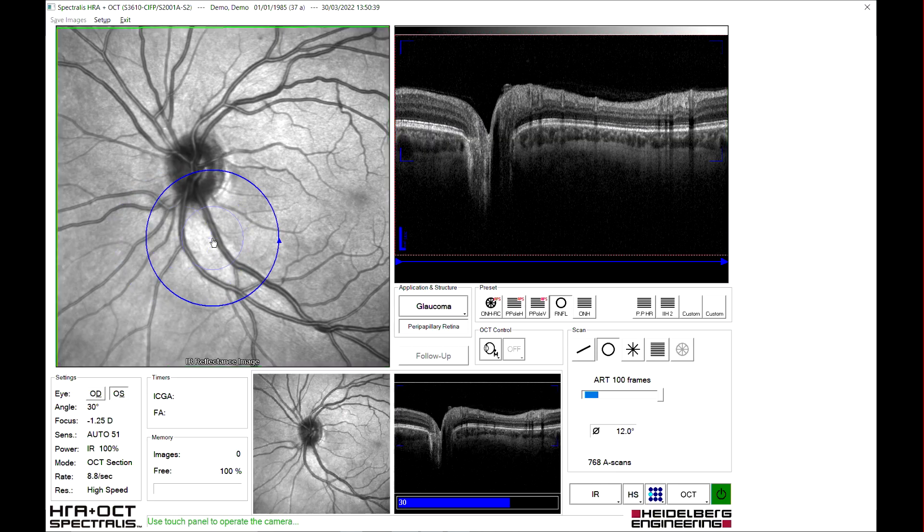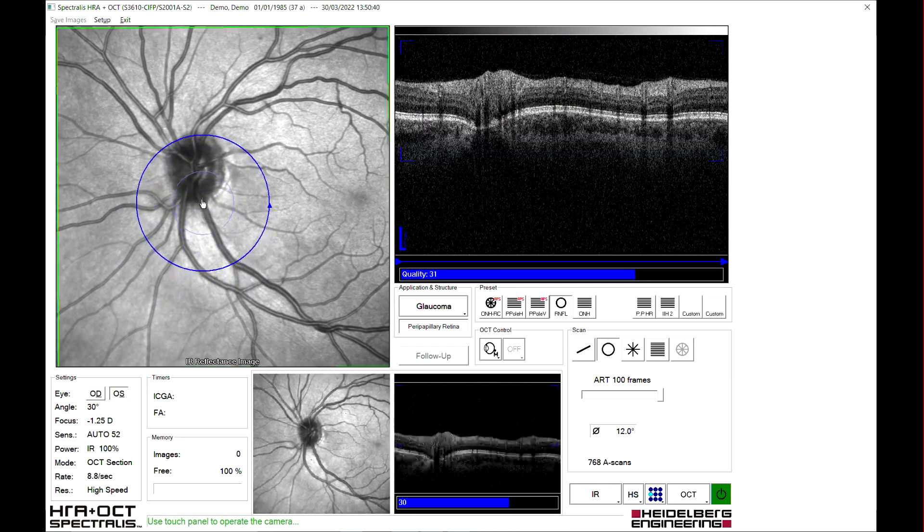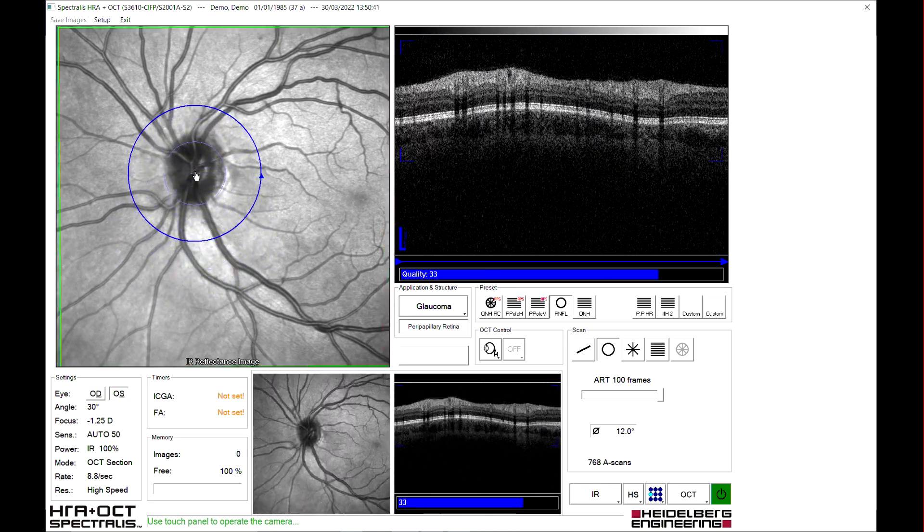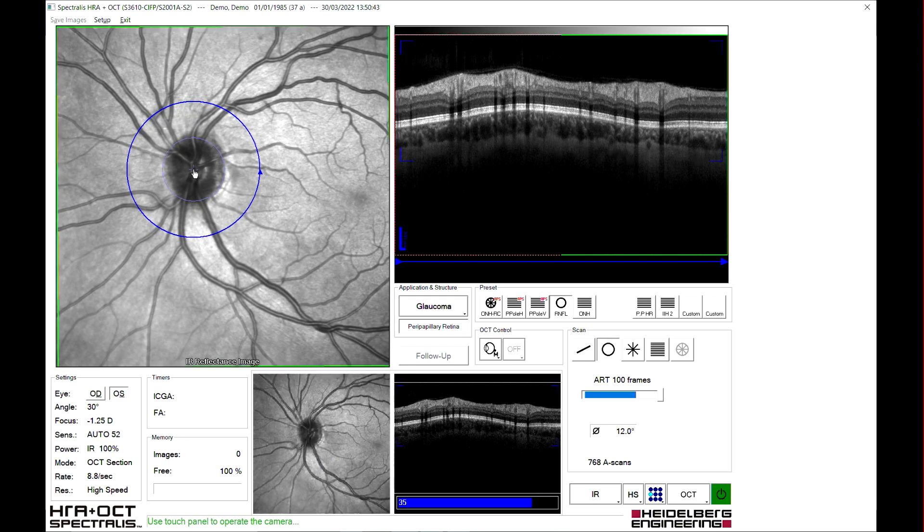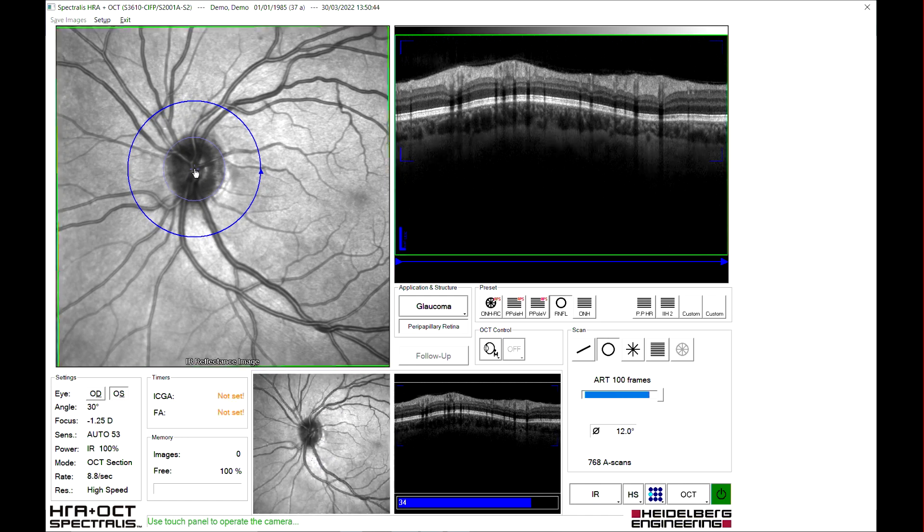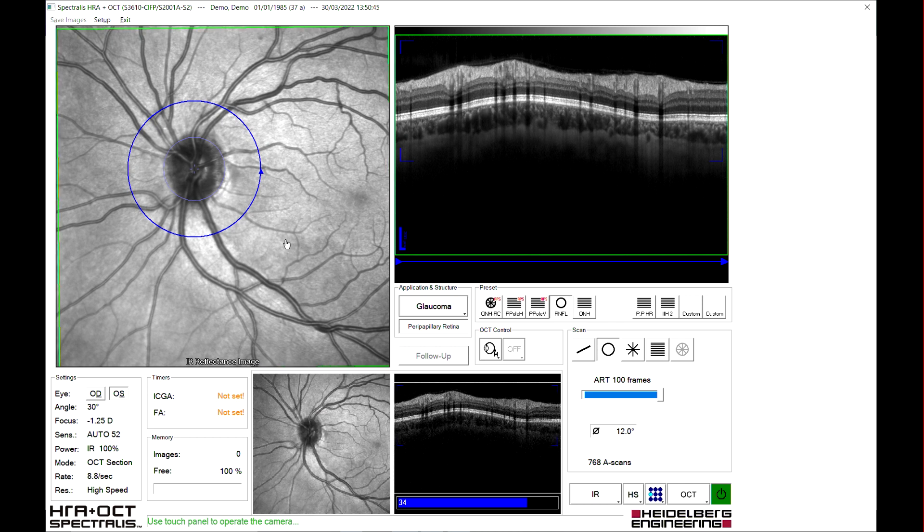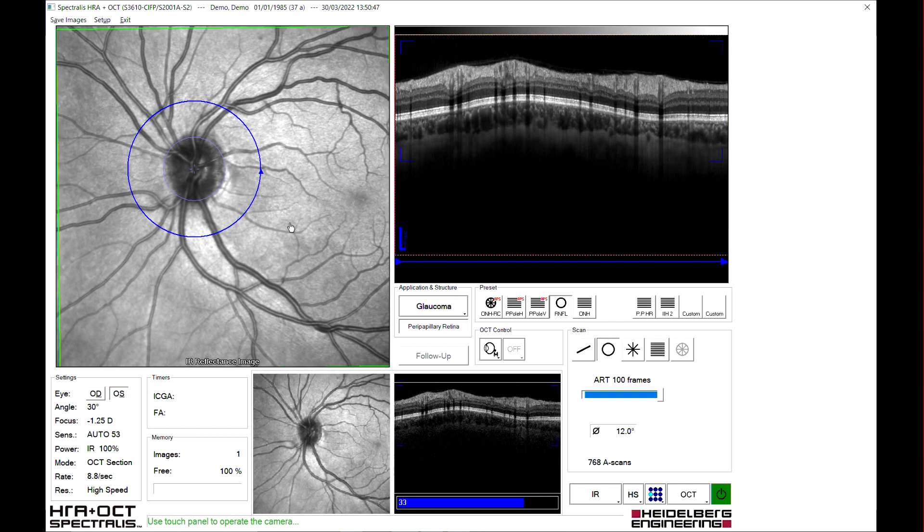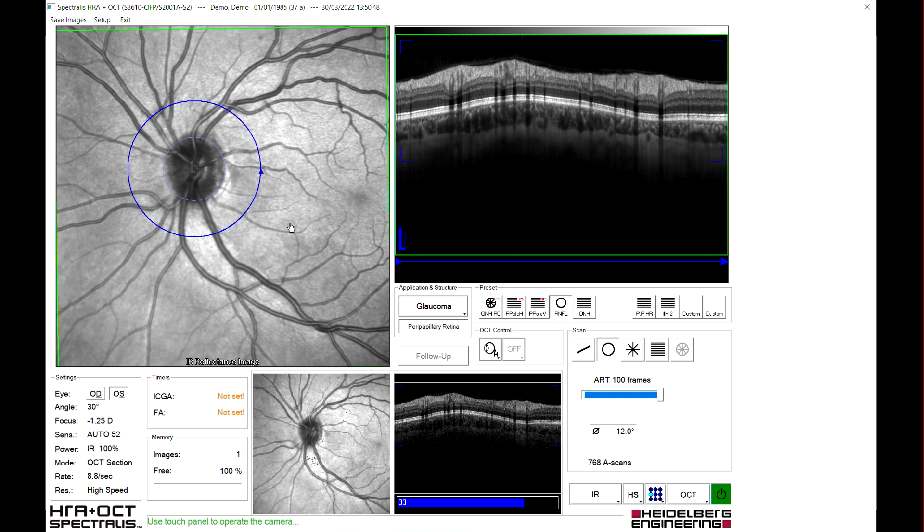It is vital to align the baseline scan correctly as this will determine the scan position for all subsequent images. The inner circle of the scan ring should be equidistant from the edges of the disc in the inferior, superior, nasal and temporal positions.